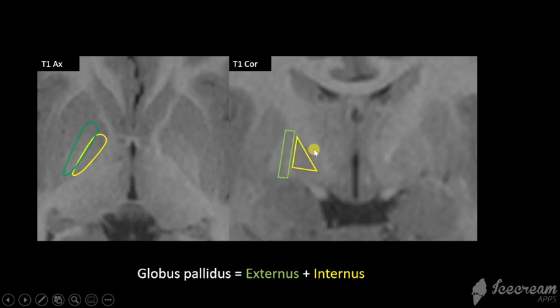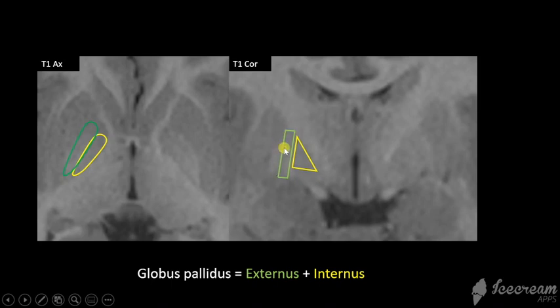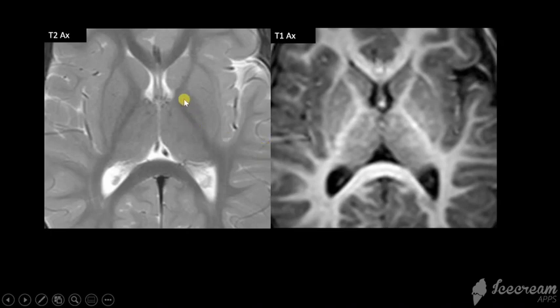The globus pallidus comprises an internus and an externus, separated by a thin layer of white matter known as the internal medullary lamina. The external medullary lamina separates the externus from the putamen. The globus pallidus is slightly dark relative to the putamen on T2-weighted images, and slightly bright relative to the putamen on T1-weighted images.